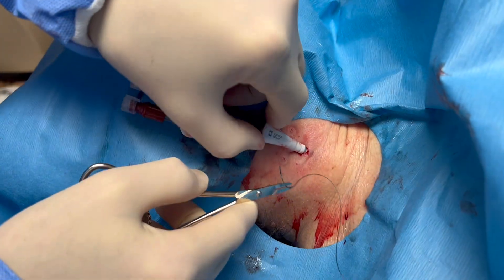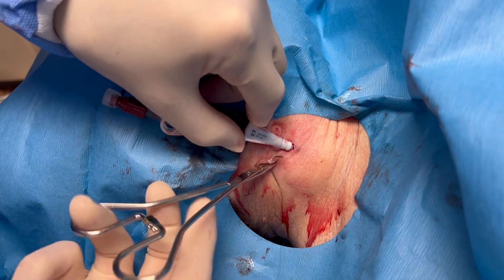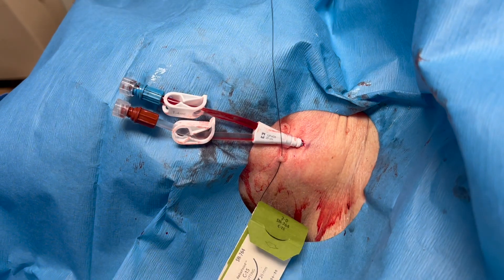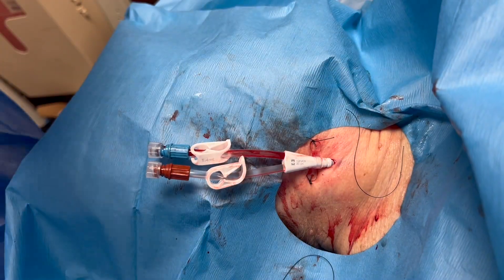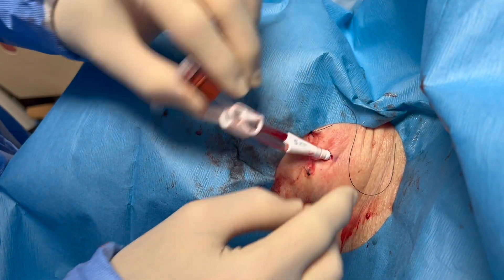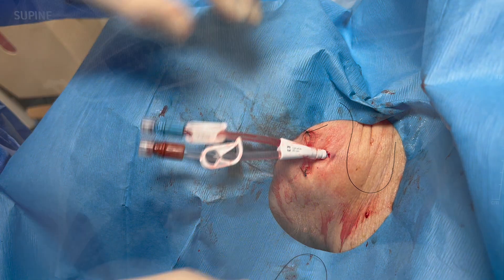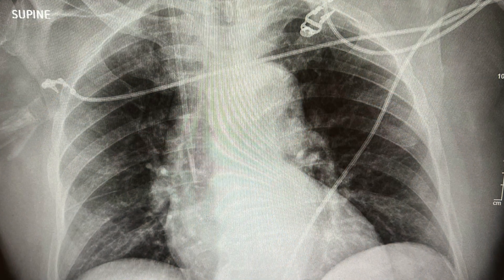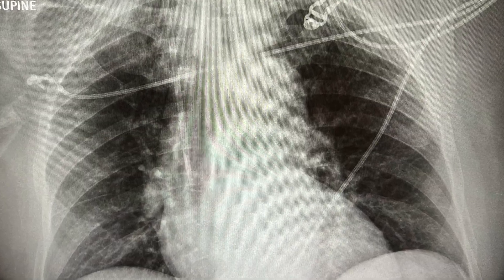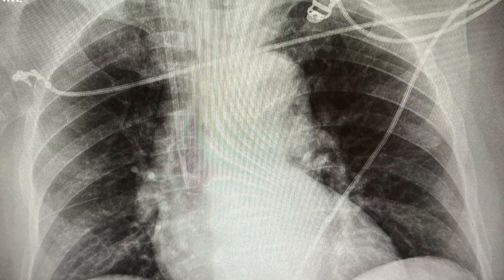Once it's in place, clean the patient up and suture it in position — usually one or two sutures will work, and the sutures are generally contained in the kit. There it is, nicely cleaned up and in good position. Obviously you'll need a post-procedure chest x-ray to see exactly where the catheter is. Here you can see it goes down nicely into the superior vena cava. Your catheter is ready to go — you can dialyze your patient. Good luck.